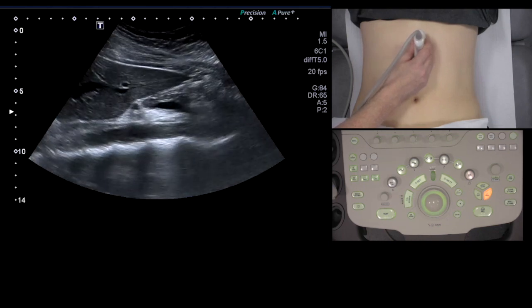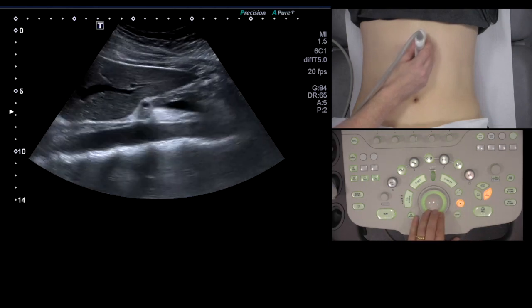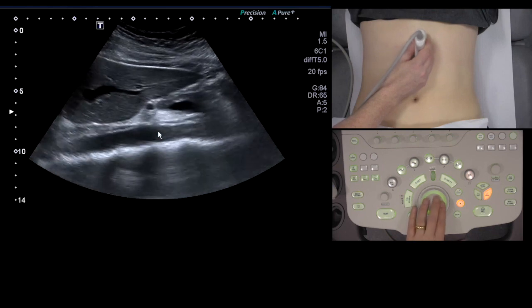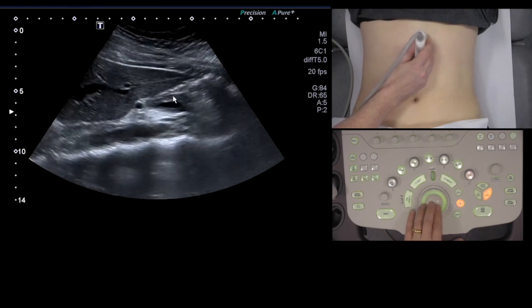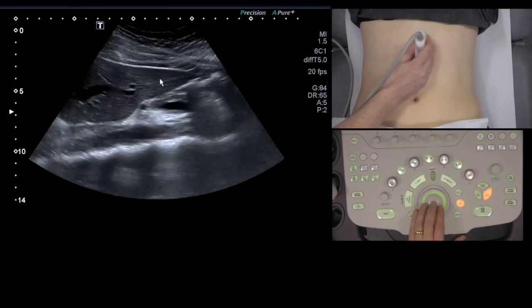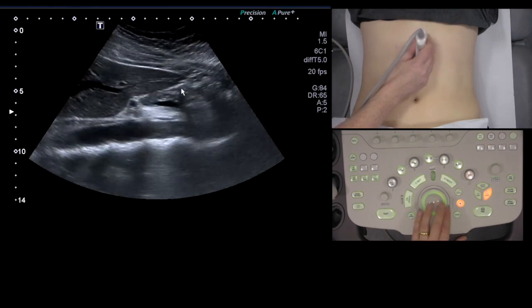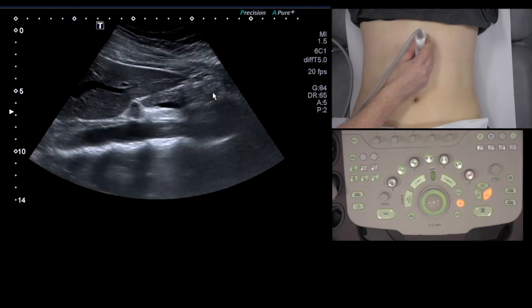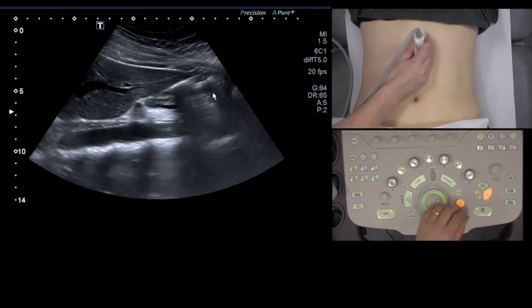I always start to scan the pancreas in the long section, and this is what you see. You can see the spine, abdominal aorta, pancreas, left lobe of the liver, and adjacent to the pancreas is the bowel, which is often what causes problems and obscures the pancreas.